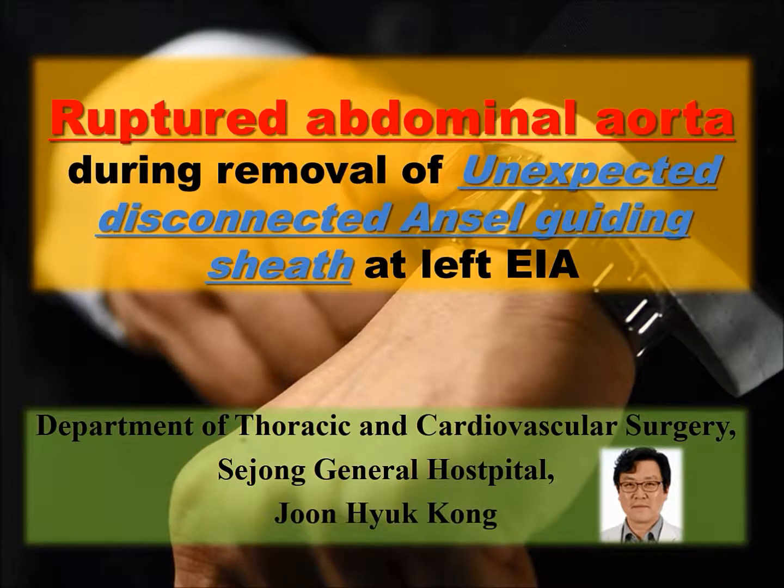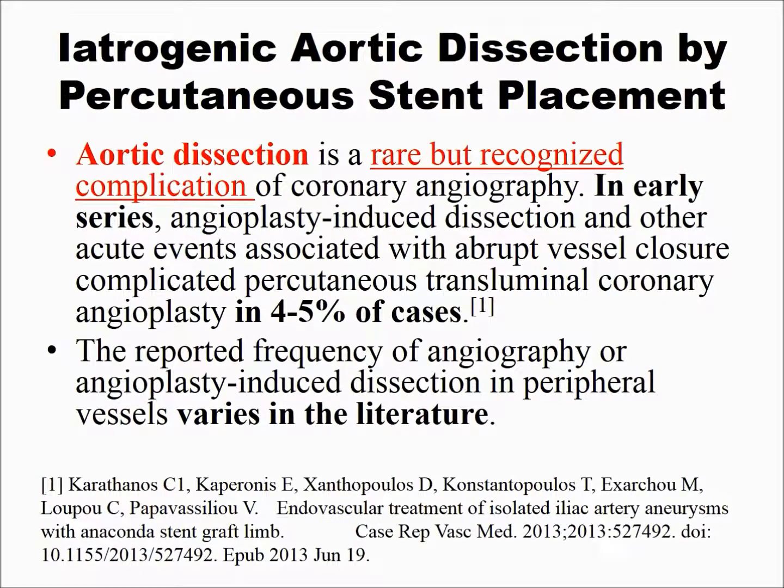I'm glad to present an iatrogenic ruptured abdominal aorta at the iliac bifurcation site during the removal of an unexpectedly disconnected Ansel guiding sheath. Iatrogenic aortic dissection is a rare but recognized complication. In early series, angioplasty-induced dissection and other acute events developed in 4 to 5% of cases.